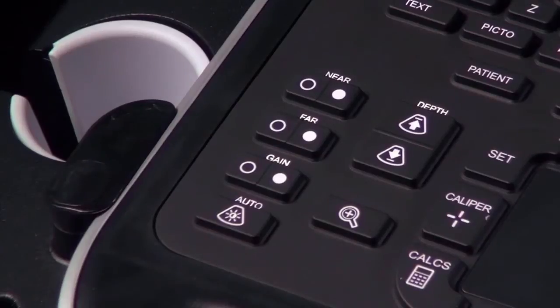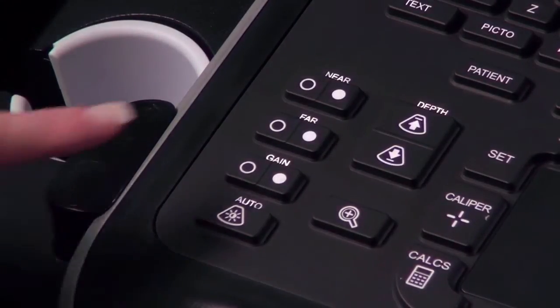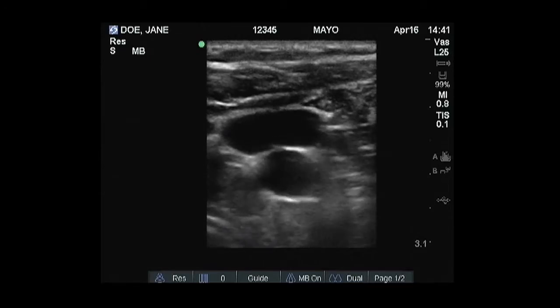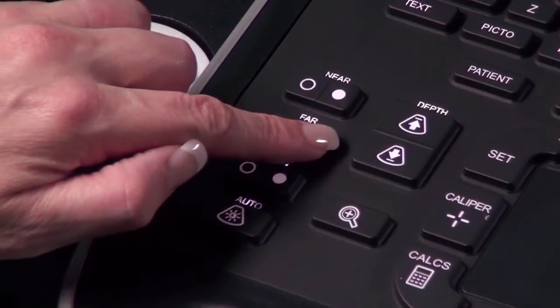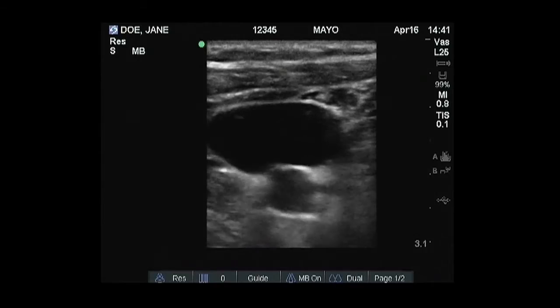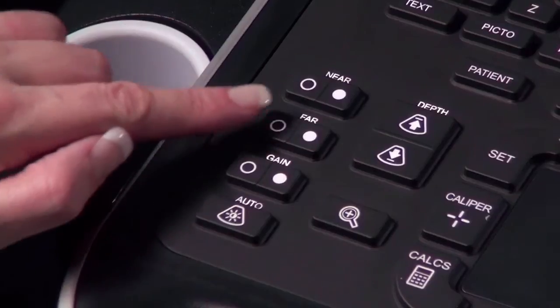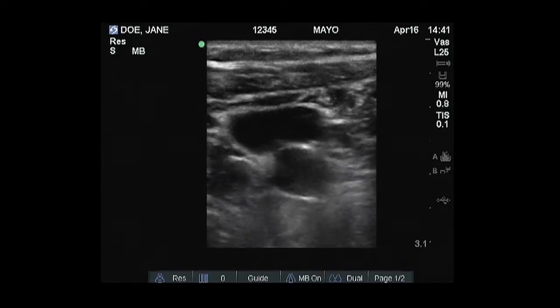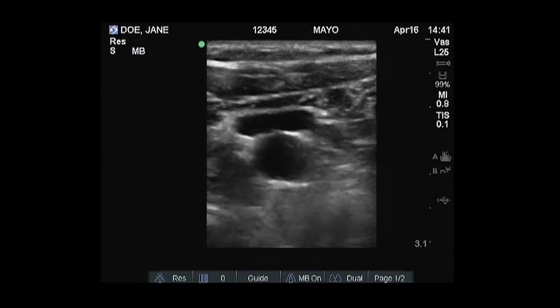If you would prefer to change the gain settings manually, adjust the Near, Far, or Gain keys on the lower left side of the control panel to increase or decrease the amount of gain applied to the Near field, Far field, or the overall image.